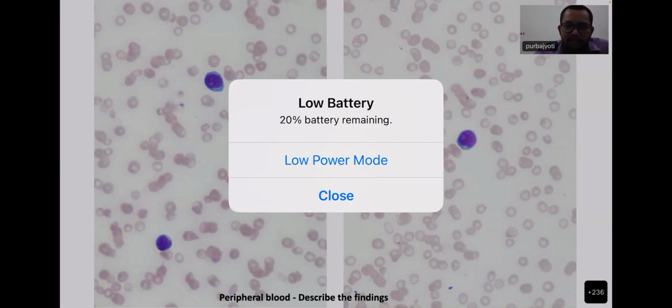Acute leukemias. If it's not acute leukemia, then lymphomas. Normally where do you find these kind of cells? Suppose the hemogram is normal, hemoglobin is normal, platelet counts are normal, and you find these kind of scattered cells in the peripheral blood. What will you suspect? Reactive lymphocytes. Yeah, virocytes, downy cells sometimes. These are immunoblastoid-looking cells. So these are frequent. Just don't jump and say they are blasts.